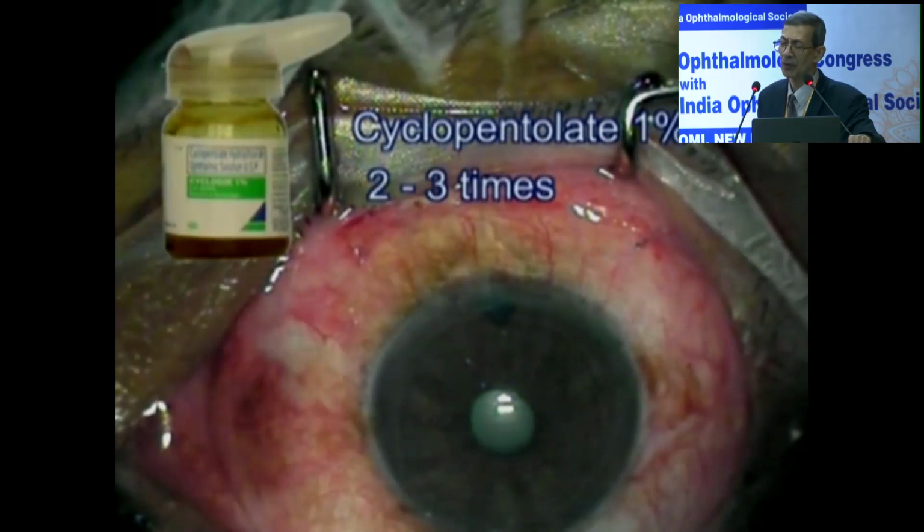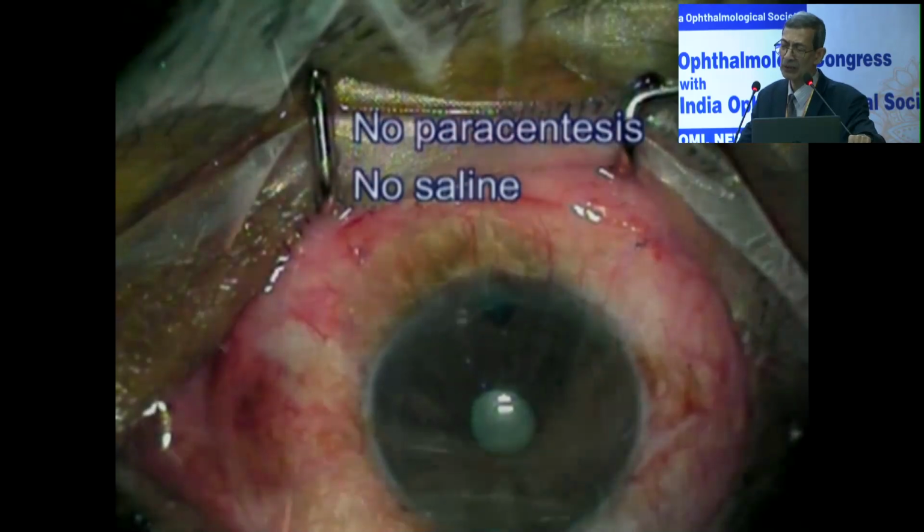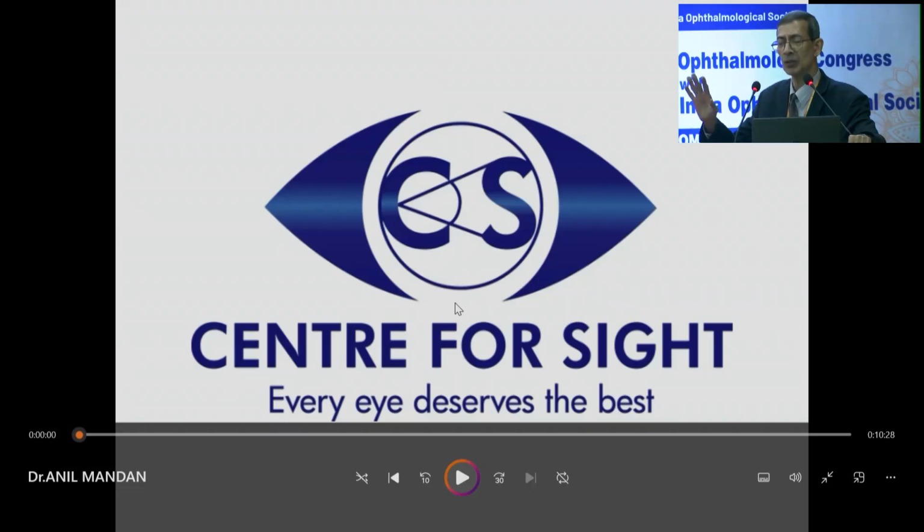Somebody may put a fluorescein drop, which I really do not prefer, to avoid spoiling the surface with fluorescein pigmentation. No paracentesis, no saline injection into the anterior chamber. I personally believe this is the way to go.